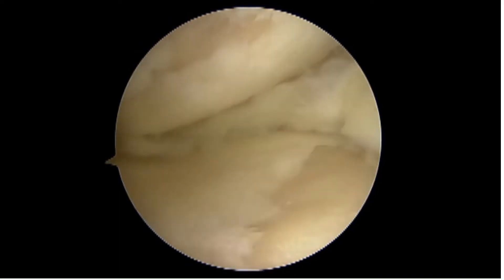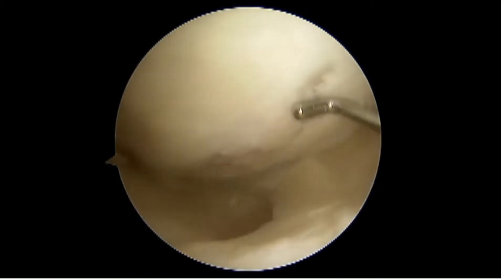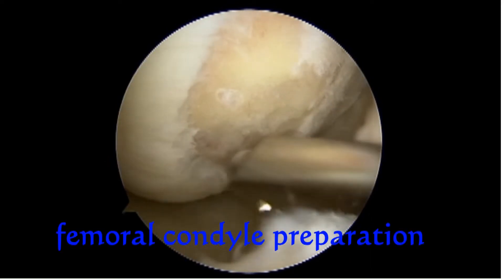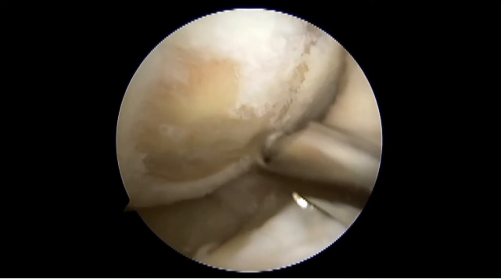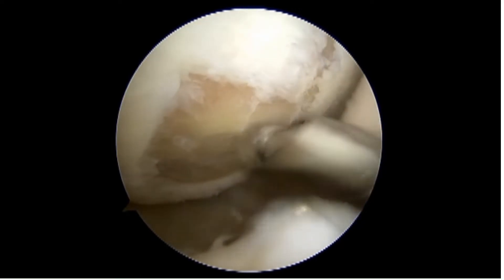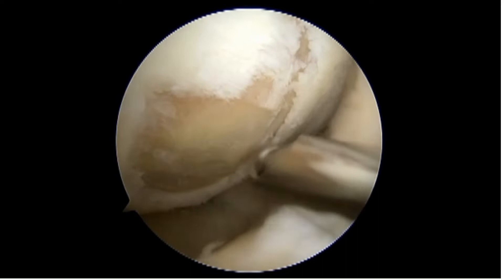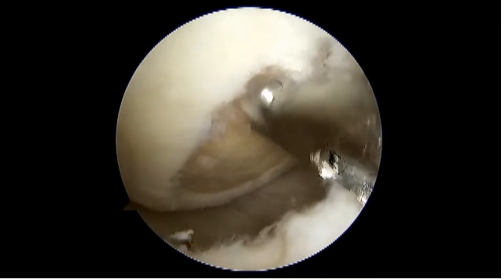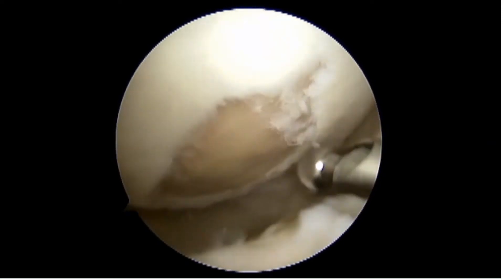Cartilage defects were found in the medial femoral condyle as well as in the medial tibial condyle. Preparation of the defect site was performed with an arthroscopic burr. All unstable cartilage fragments were removed with the power burr until viable subchondral bone was reached.